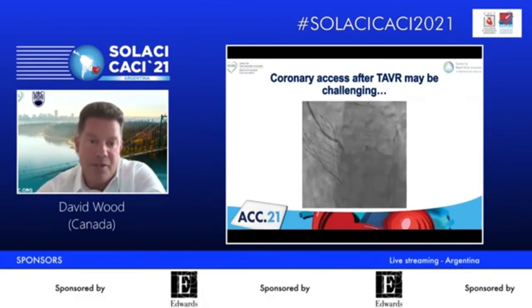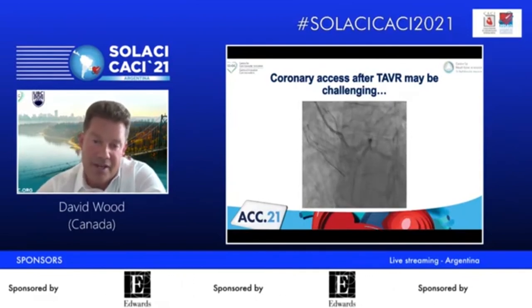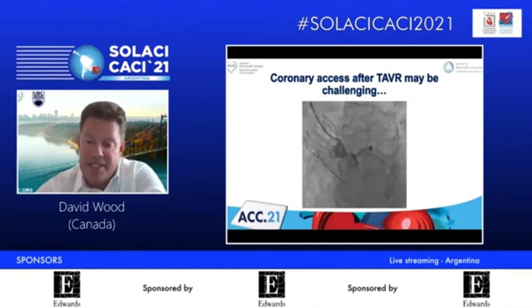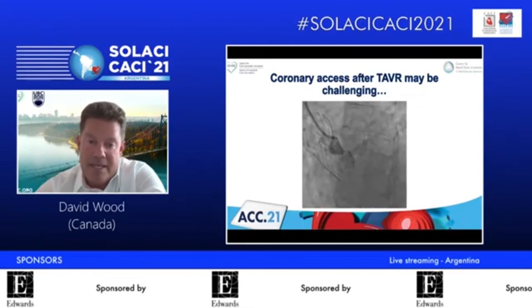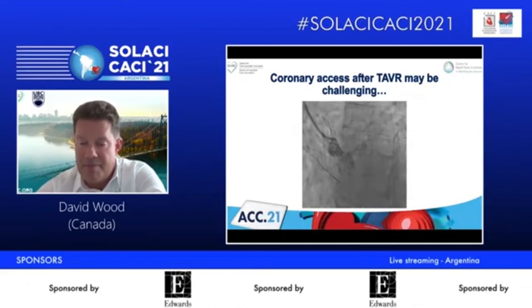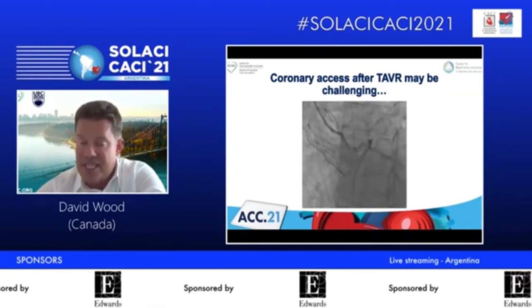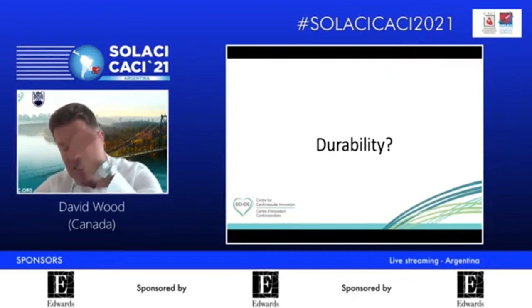And I'll get back to it, but we'll circle back in about 3 minutes to complete TAVR, because we think it's going to address the question about whether you should or should not treat the coronaries after you put the THV platform in, but also about coronary access, specifically in a short frame valve, which I think will give a lot of us a nice warm feeling in 2026 when we can show hopefully that most of the time, in the 2000 patients randomized to staged stenting, coronary access is not a huge issue, or if it is, that there are tips and tricks to mitigate it.